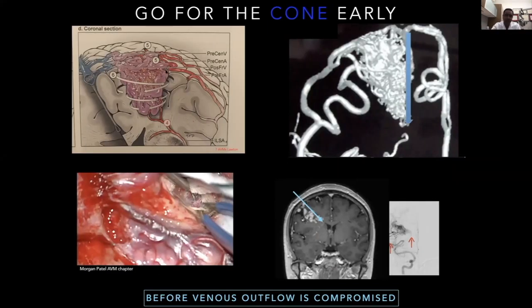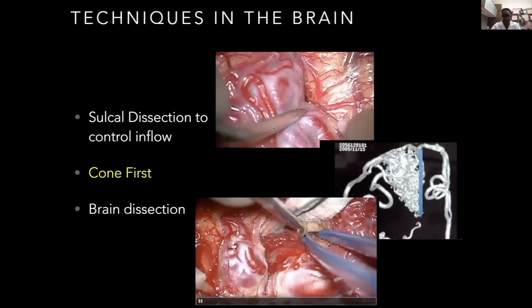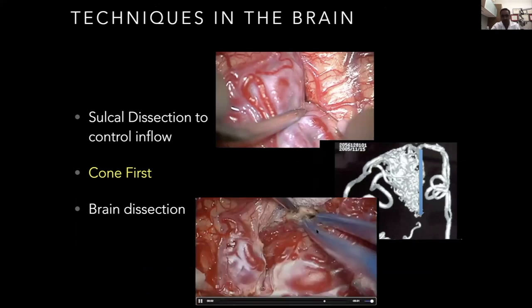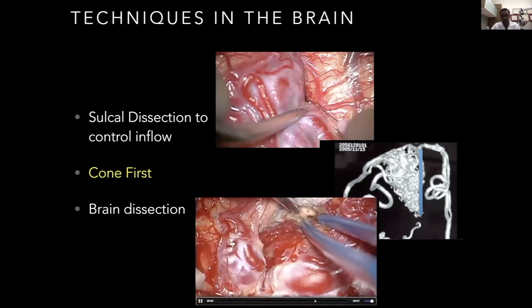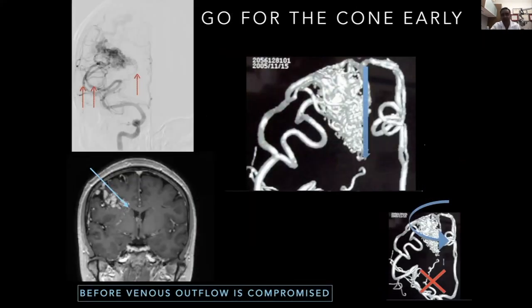So on the left top here is the sort of standard tornado view. But when you get down to this number 4, it's supercharged because the veins around the AVM nidus have been tree barked, injured. So instead, go straight down early in the operation. Here's an illustration of that. In this bottom, you know, using the bipolar, sweep the vessels back in. I'll show you some more cases. But I think this really works. Getting to the bottom early obviates the need for preoperative embolization. You're doing the embolization by surgery and it's in your absolute control.